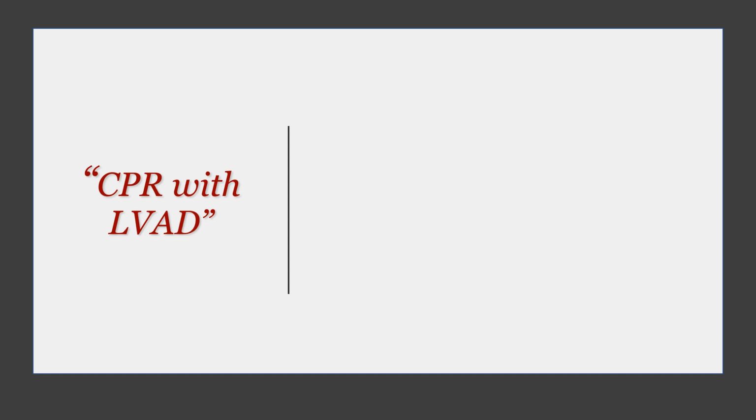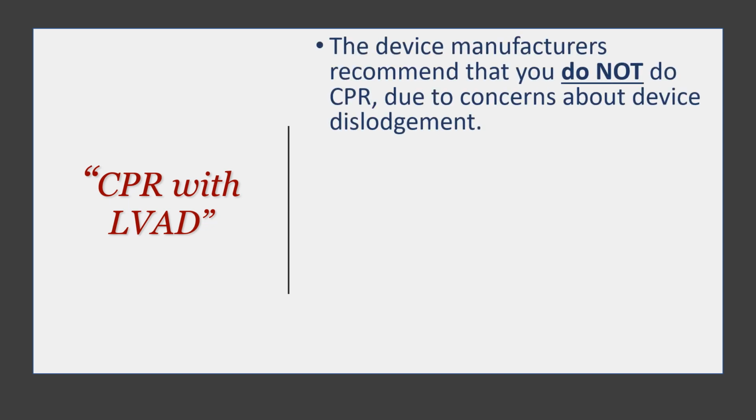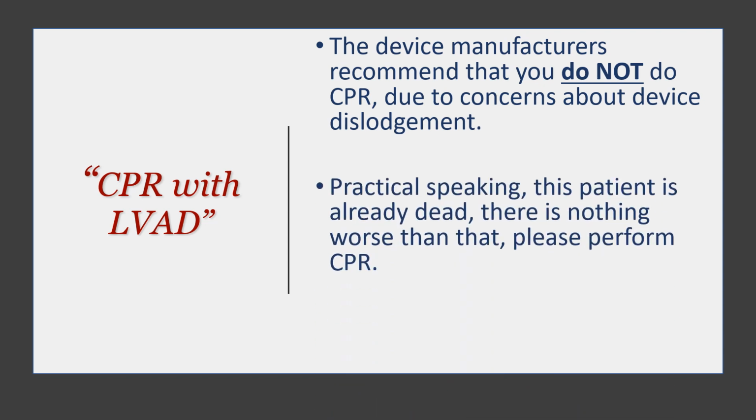How about CPR with LVAD? Well, interestingly, the manufacturers recommend that you do not do CPR, and that is because they are concerned about the device being dislodged, which is quite an interesting thing because, come on, this person is in a cardiac arrest. This person is almost dead. So what else are you going to wait for before doing something? Personally, I would start CPR immediately for a patient like this.